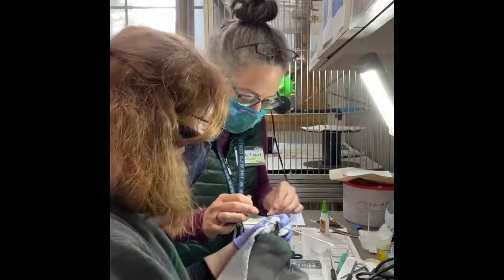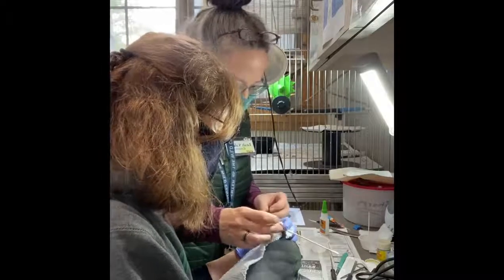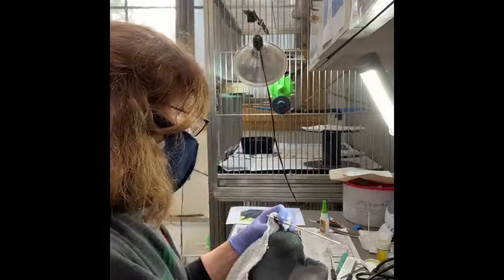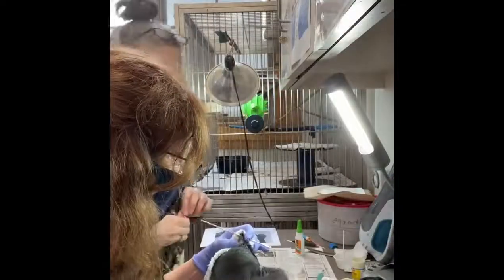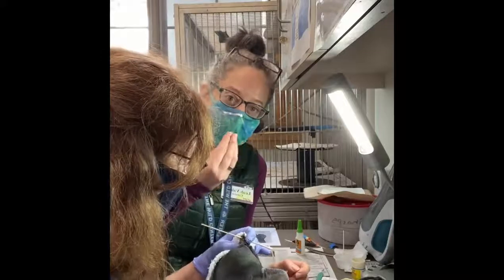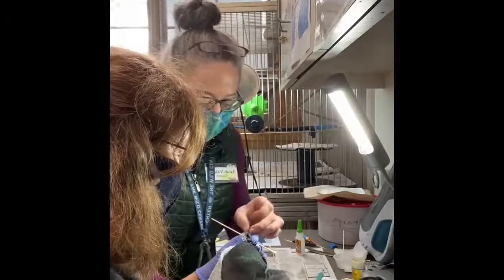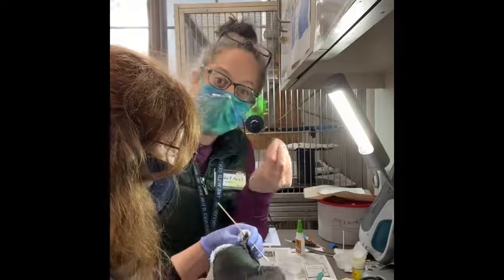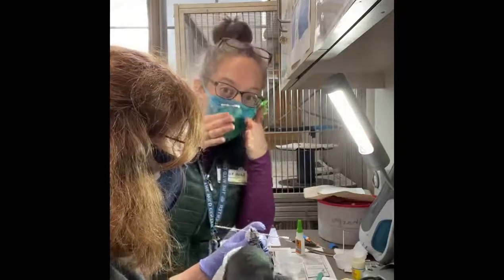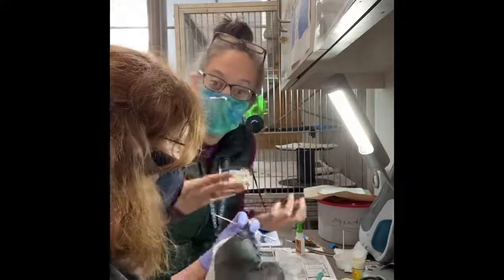All right, honey. Let me set you up a little bit. Wait for it to dry and then Dremel it to shape — it's pretty dry, but I just want to let it sit a little bit longer. So we're just waiting for the glue to really firm up. What we need to do now is shape that piece of feather shaft so that it's basically a beak shape. I'm hoping the feather shaft will not only allow her to eat because it'll function as a tip, but it'll take that part of her beak that's growing sideways and kind of almost form a splint that will help that beak grow straight. Eventually, the beak will grow and we will just keep trimming the feather shaft down until it's her normal beak.